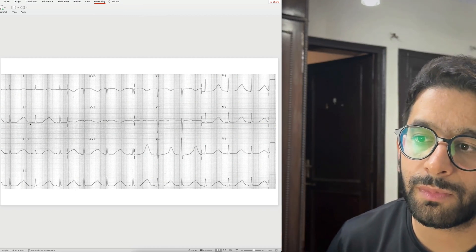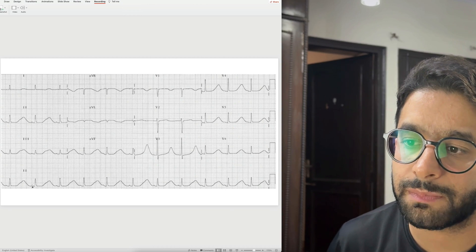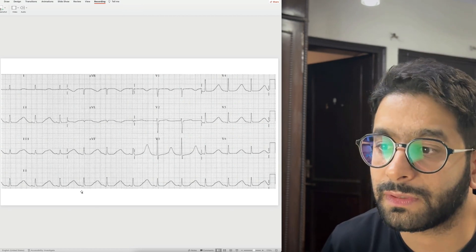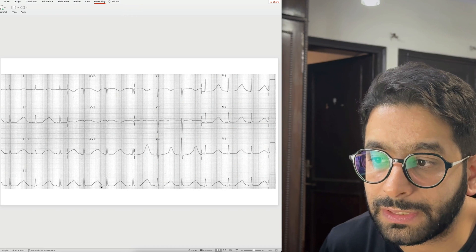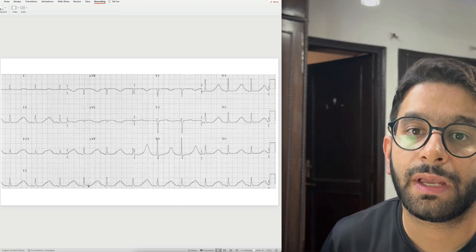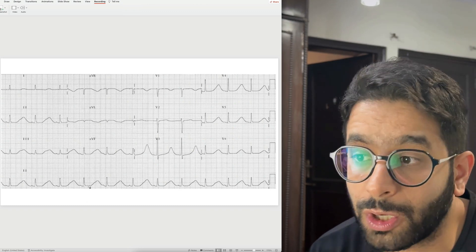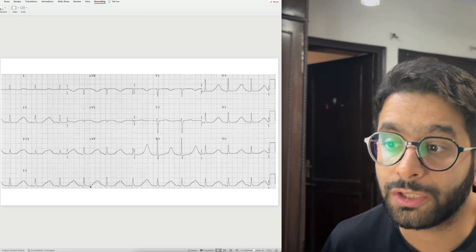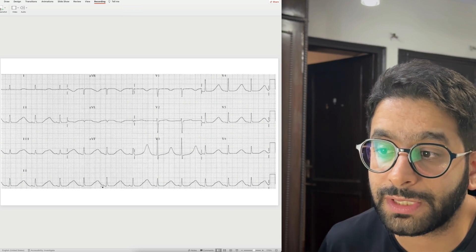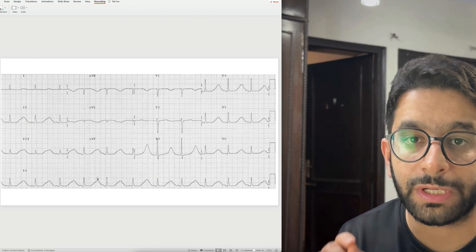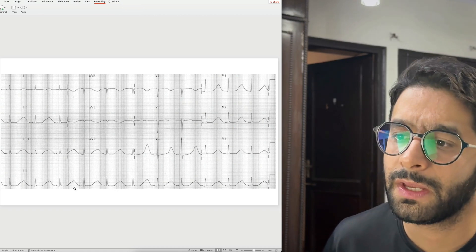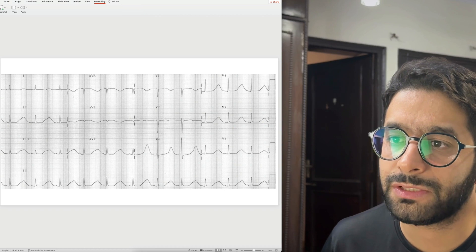This ECG looks normal — P-QRS-T, P-QRS-T — the ST segments are neither elevated nor depressed. What is wrong here is the QT interval: from the start of the QRS complex to the end of the T wave, look how prolonged it is. If the QT exceeds half of the RR interval, you should be worried that this is likely a prolonged QT. Otherwise you should be checking the corrected QT interval using the Bazett's formula. QT prolongation can lead to fatal arrhythmias.